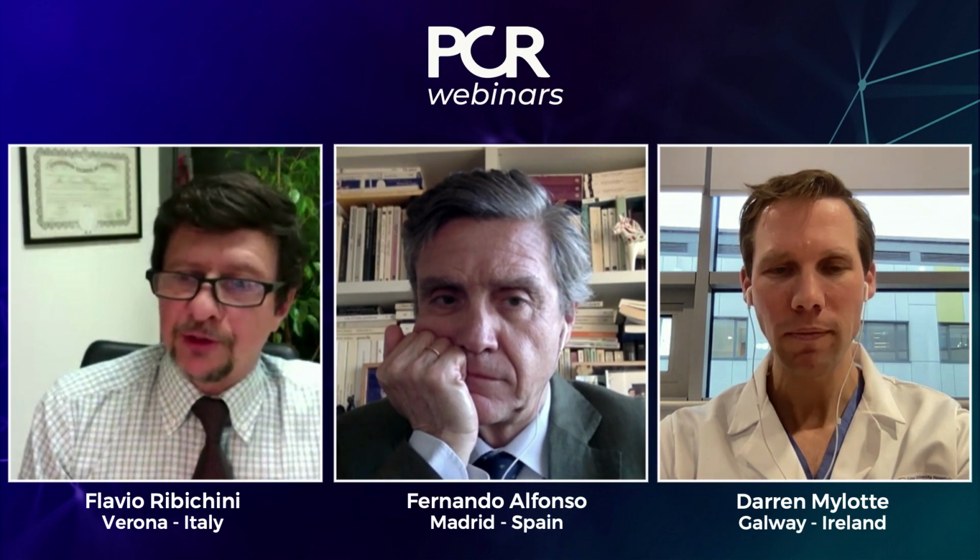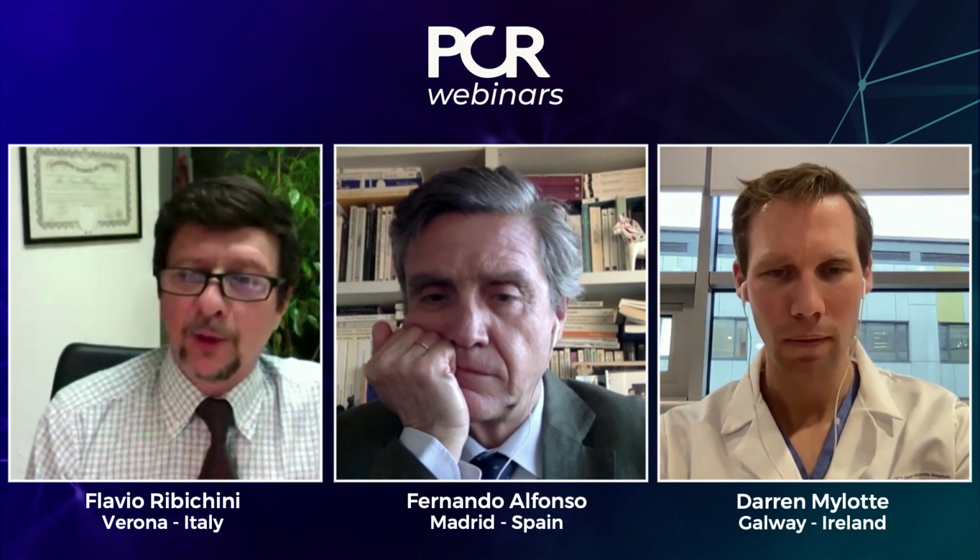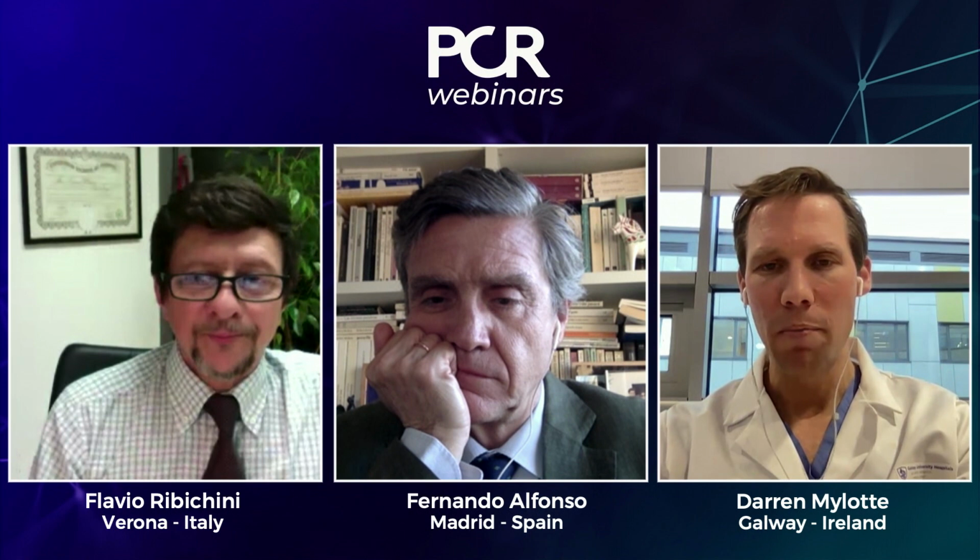Okay. Bifurcations, Darren, is that a good indication for DCB, treating the side branch or a bifurcation with 2 drug-eluting balloons? Yeah, I'm a provisional stent guy, and so I like the option of provisional stenting. And then when I have a long lesion in the side branch that really doesn't look great, I like doing a final kissing with a DCB in the side branch and indeed a stent in the main vessel. Can you use 2 DCBs? Absolutely. This can give you a very nice result. You don't have a metal carina. You don't get carina shift. So yes, this can be a good option. Still, it is not recommended. It's still not in guidelines. It's just practice, but we have no evidence on that.